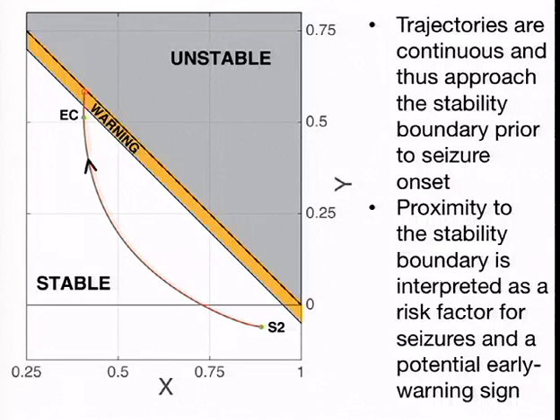And then for your second question, yes, we assume a lot by characterizing the brain state purely in terms of the power spectrum. But I think one of the things that we're most interested in doing is seeing how far we're able to get using just the power spectrum alone. And certainly in our work with sleep staging, one of the biggest challenges that we have, leaving aside just EEG alone, is that the power spectrum between wake with your eyes open and then REM sleep and sleep stage 1 is very, very similar. And so REM, for example, when you're dreaming, is primarily differentiated from light sleep by muscle tone, which of course is not measured directly in the EEG.